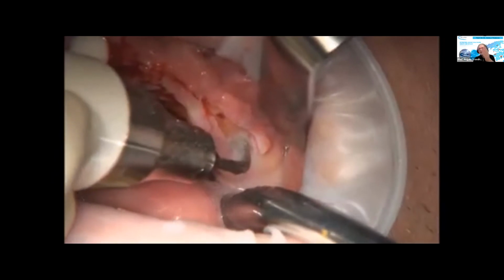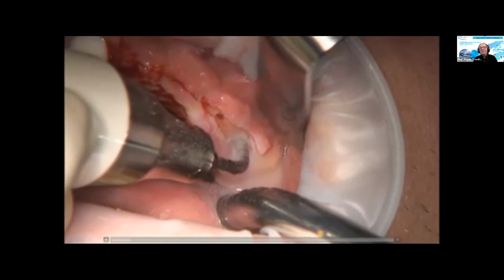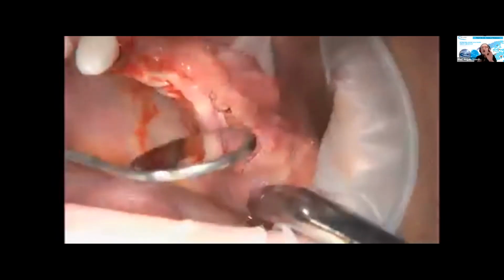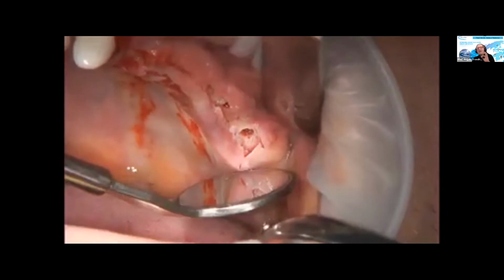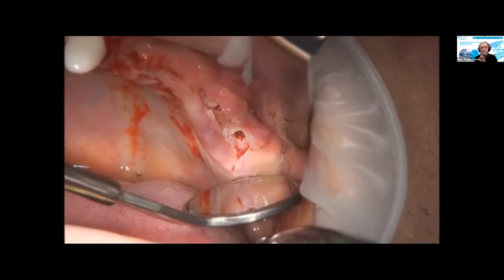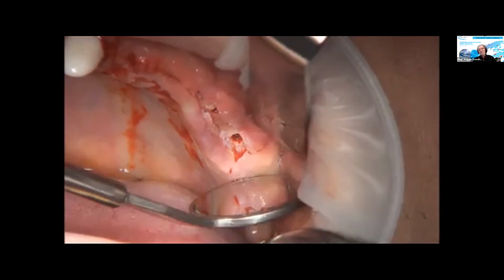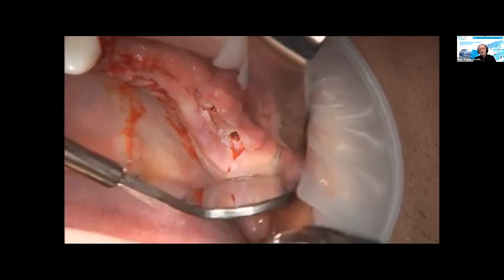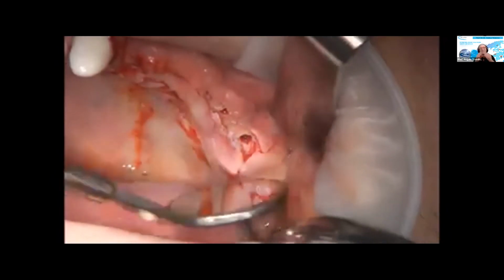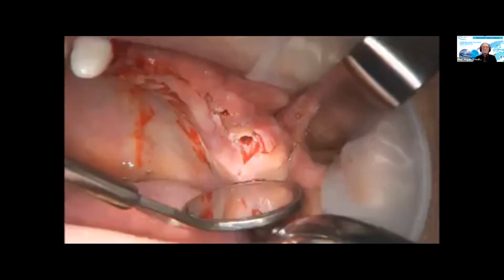At the beginning, you know you have 4 millimeters, and you see here the laser markings. You know how far you can get in forcefully. But on the last millimeter, please be gentle, because suddenly the bone is opened, and then if you put too much hand pressure, of course, you will perforate the membrane also with the INTRALIFT procedure. Because unfortunately, we still have to deal with the very, very delicate sinus membrane.